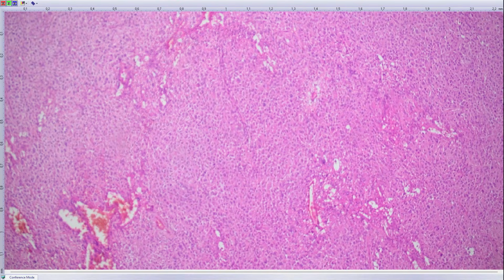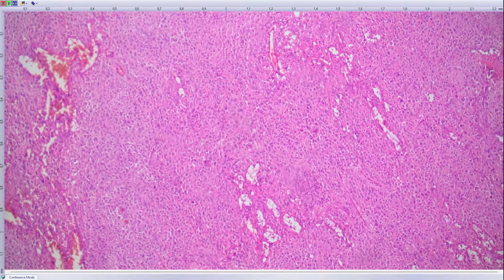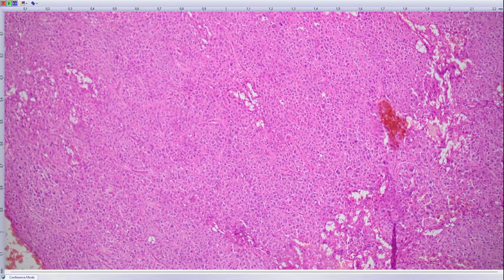I could think then of melanoma, which is a similar story. Again, you would see multiple mitoses, necrosis, and so on. Then for mesenchymal tumors, you could think of some leiomyosarcomas, but again, with this kind of pleomorphism, you would have very high mitotic activity. Then you could think of glomus tumor, which for me would be the number 2 differential diagnosis in this case.